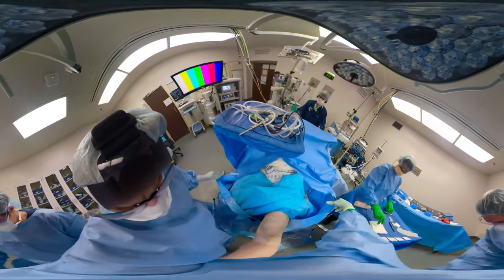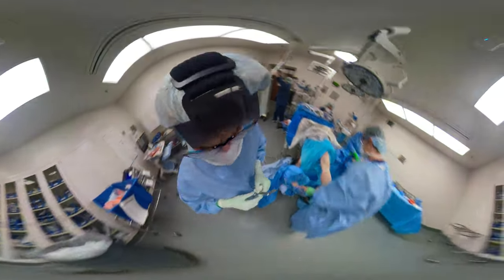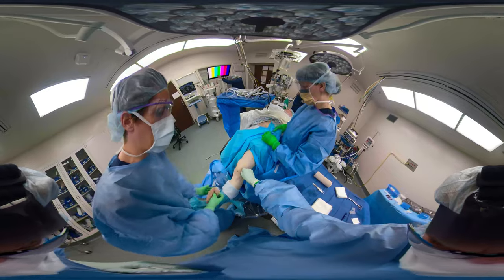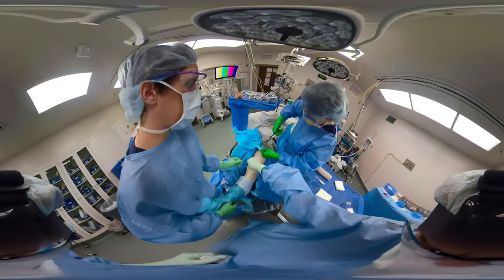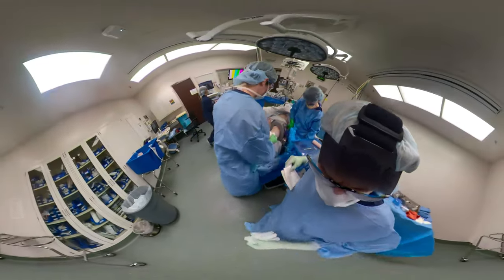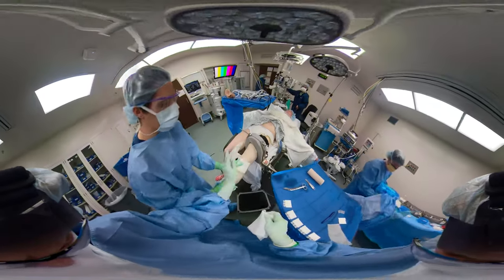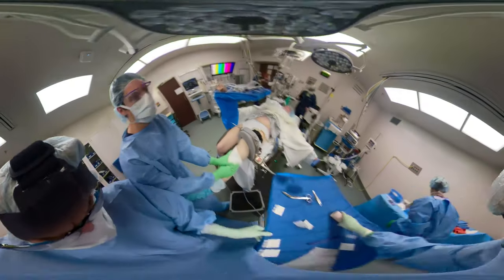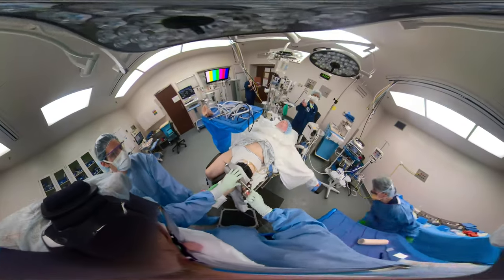Put our sterile dressing on there of Adaptic 4x4s and ABDs. The Ace Wrap should be applied not too tight, from the mid-calf to the upper thigh. Our tourniquet is still up. As you can see, the Lanny Johnson leg holder is still on the leg, and that would be a tourniquet effect if we let the tourniquet down now. So we'll take the leg holder off before letting the tourniquet down. This is the Lanny Johnson leg holder.